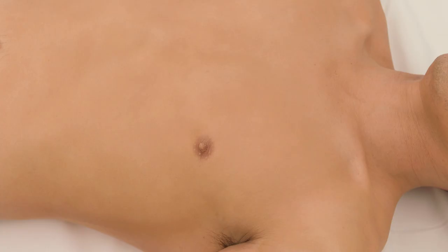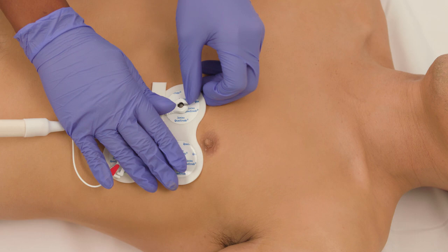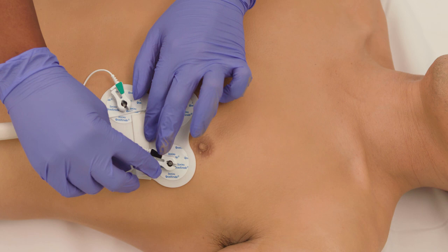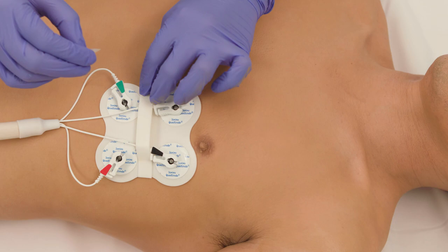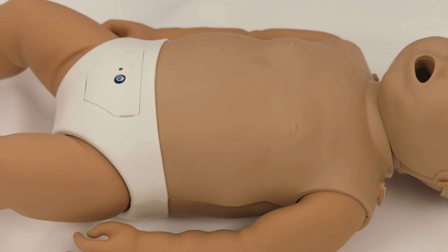When using the MR200 and the single patch electrode, place it below the imaginary nipple line. The patch will be on the left side and not in the center of the chest. For patients with larger breasts, place the single patch electrode underneath the breast tissue. When using the MR200 and the neonatal ECG electrode, place the electrode in the center of the chest.